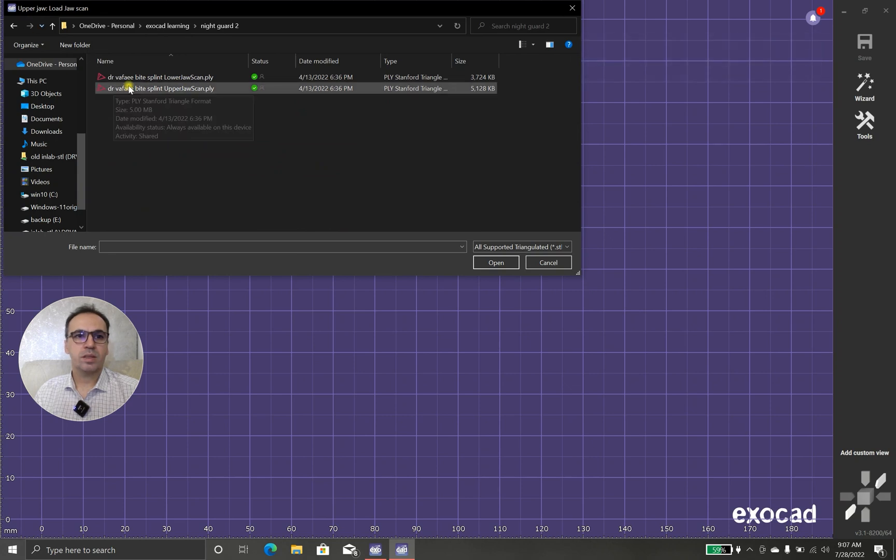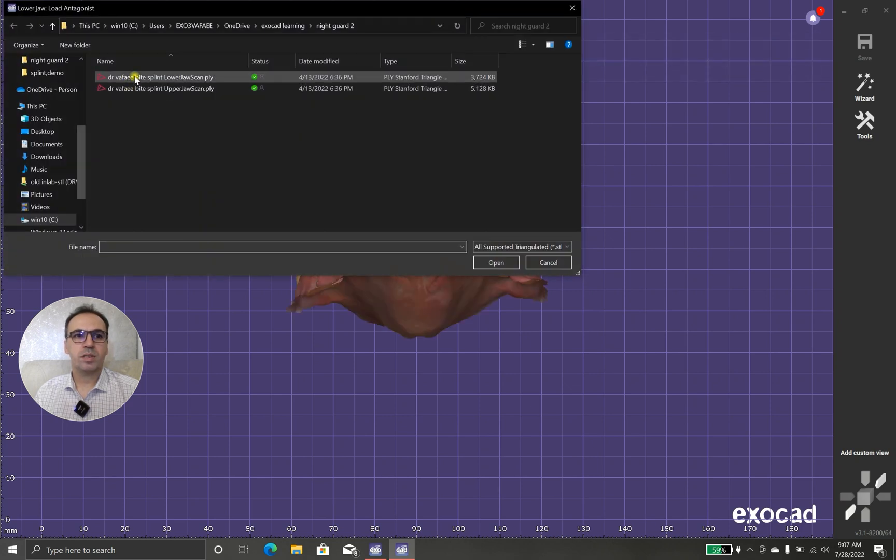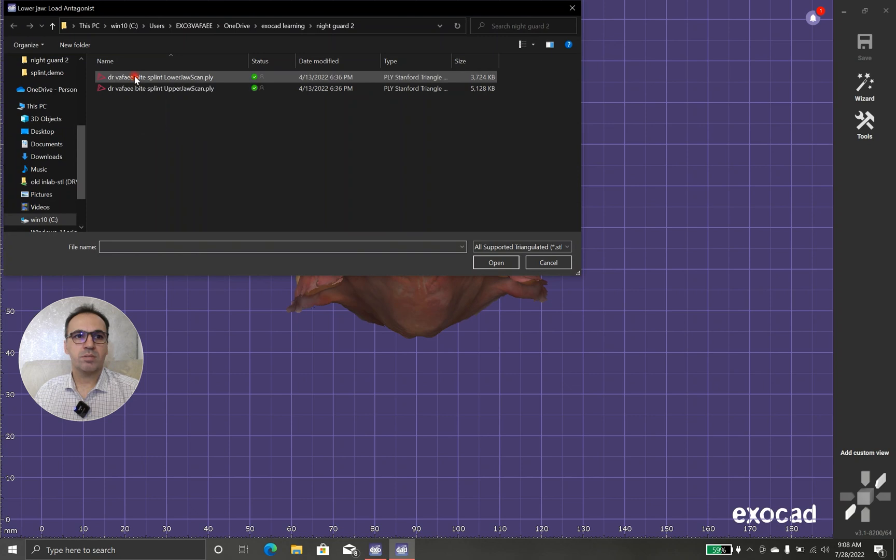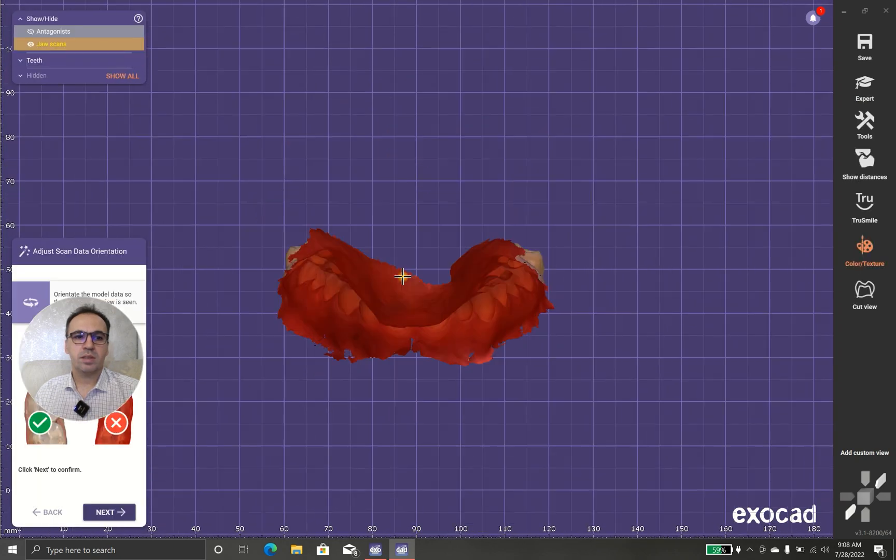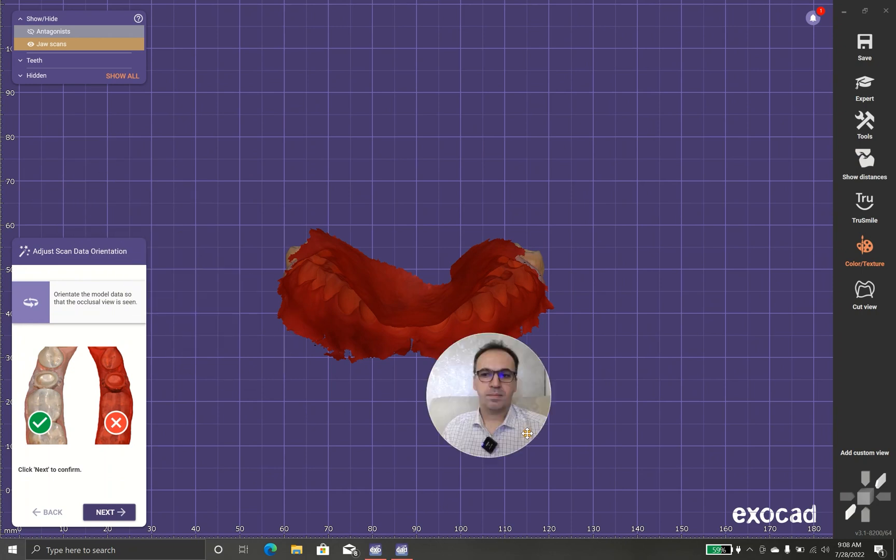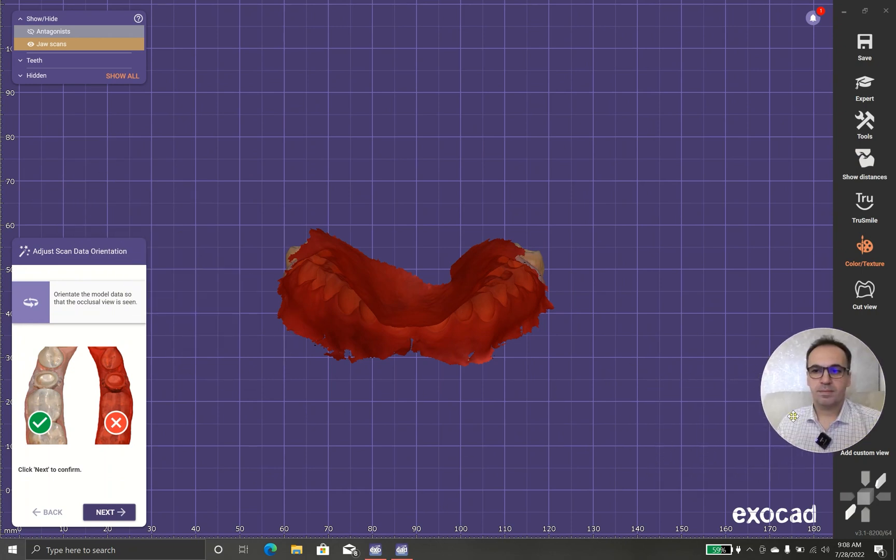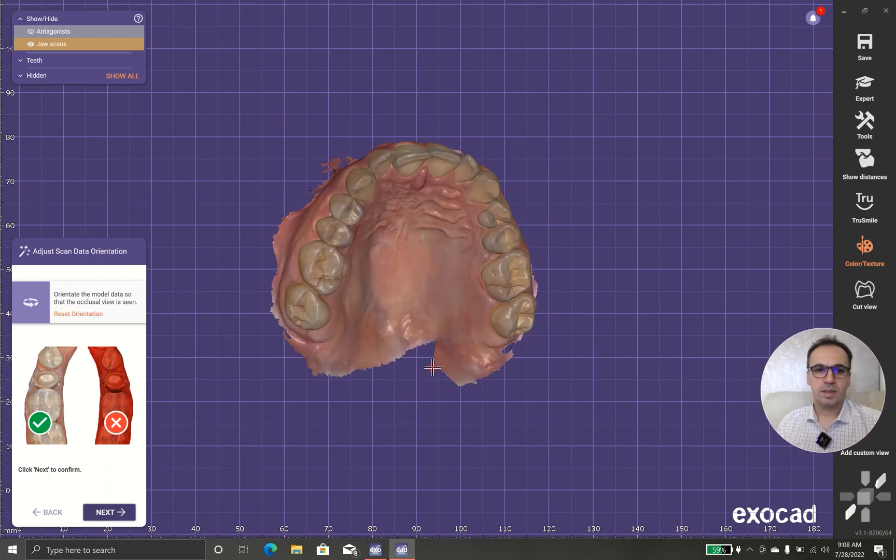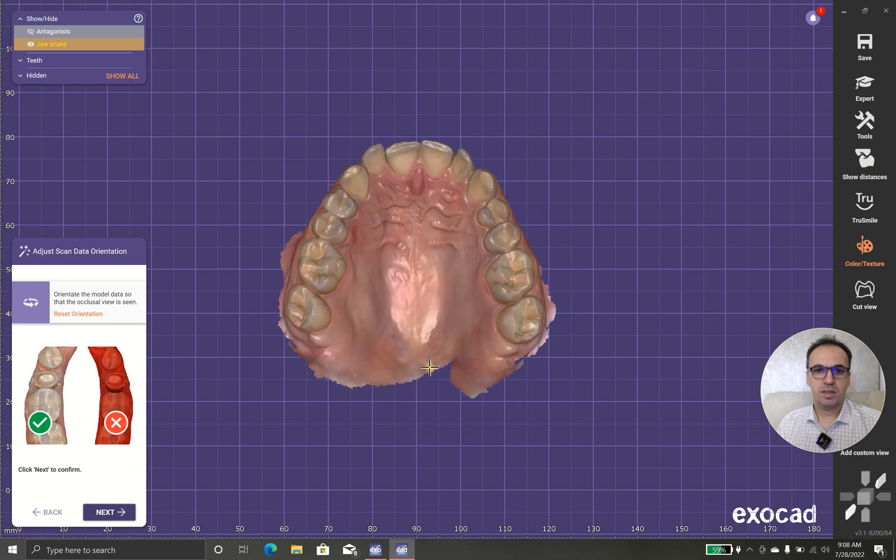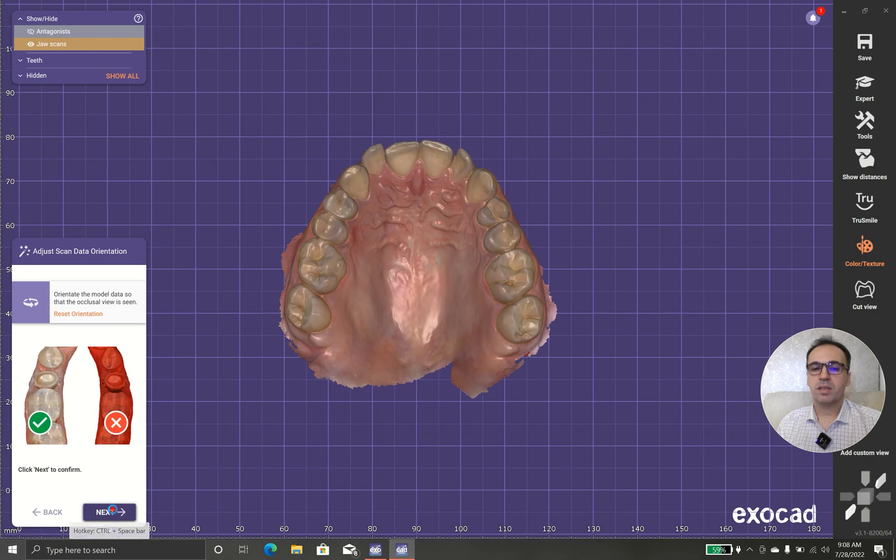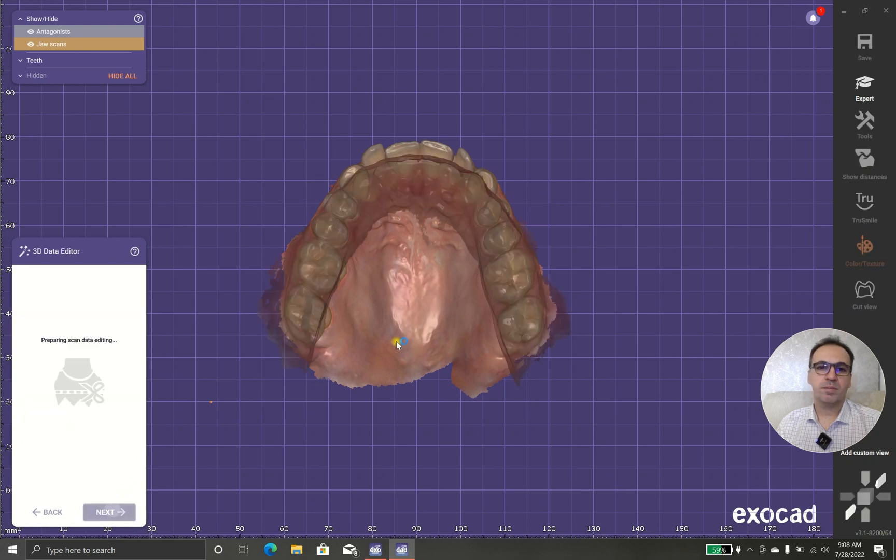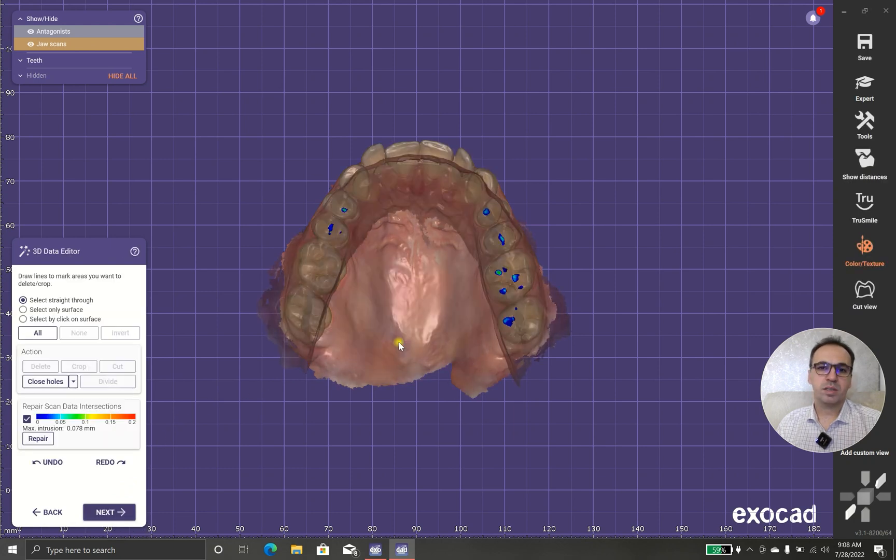Then, we are going to import our scans. This one is upper, this one is lower. As it said, it should be something like this. As you can see, in 3.1, we have better color rendering. I really appreciate this kind of color rendering.